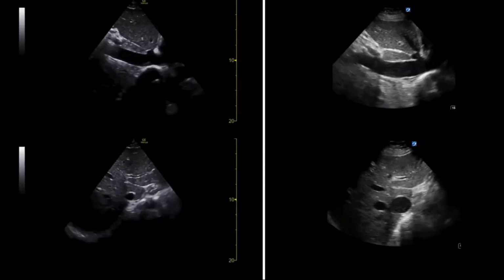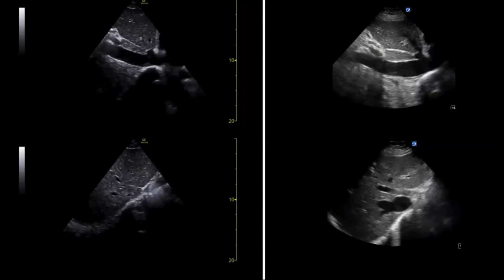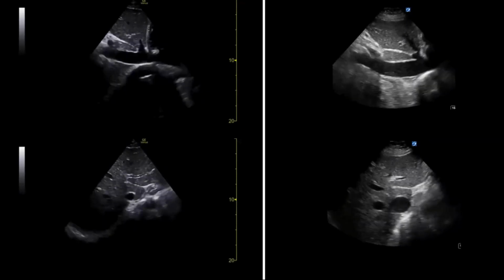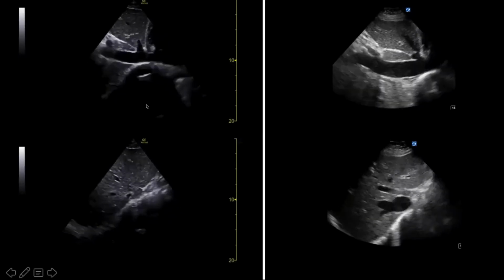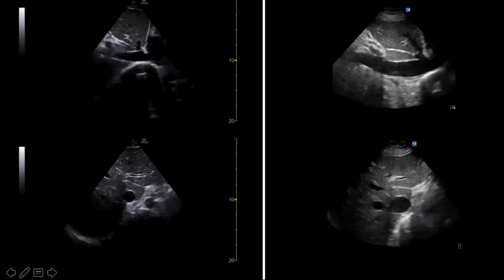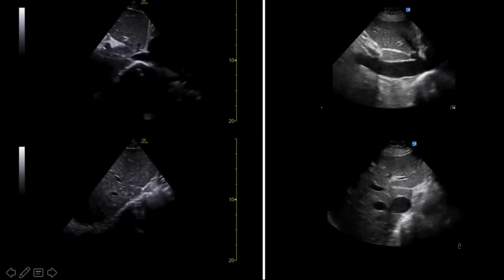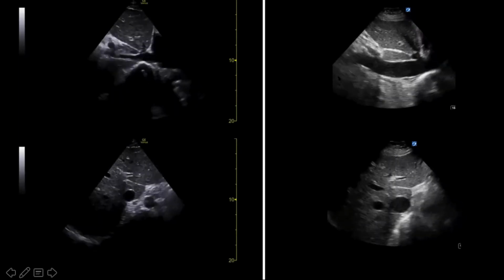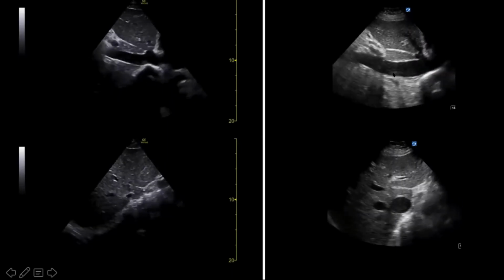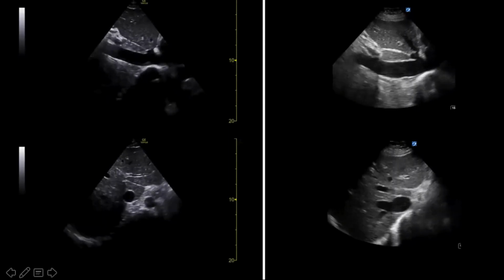And so, as you all know, the first step in evaluating venous congestion using ultrasound is looking at the IVC. I'm sure you are all very familiar with this, so I'm not going to dwell too much on it. Here on the left, I show a normal IVC in both the long and short axis with a complete inspiratory collapse. And on the right, you can see a congestive or plethoric IVC with an increased diameter greater than 2 centimeters and with almost no to minimal respiratory variation.